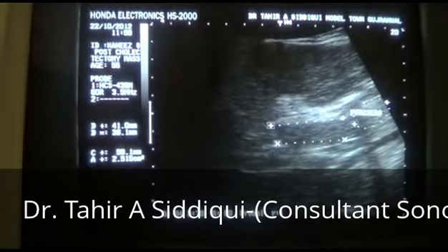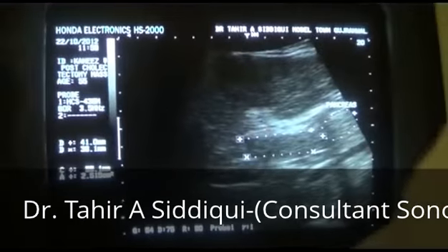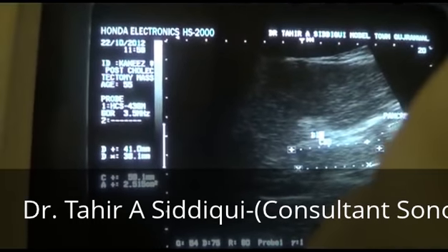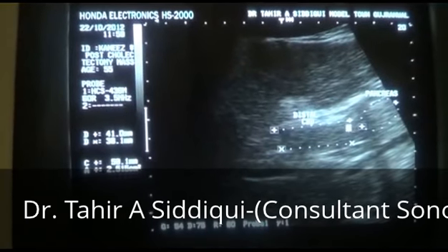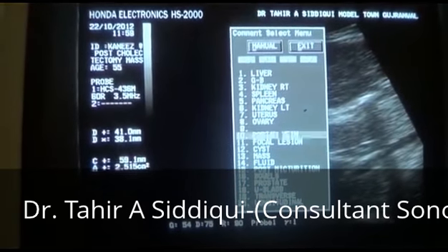This is the common bile duct, the most distal. And we know that the CBD courses the posterior inferior surface of the head of the pancreas. And this is the portal vein.